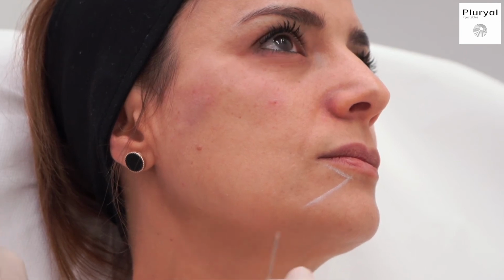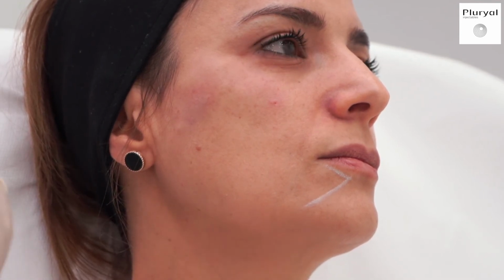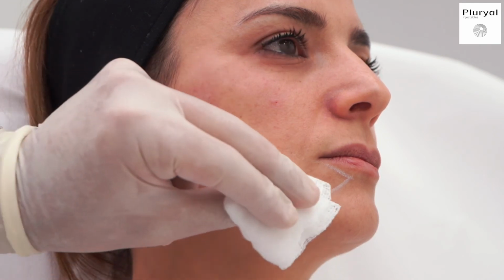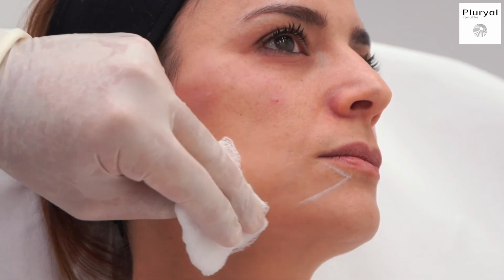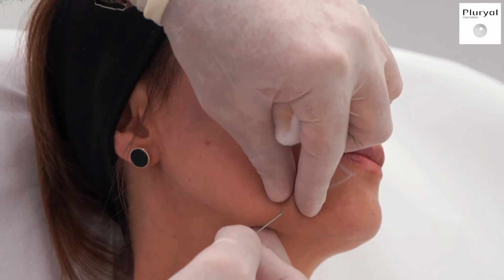The last part of today's treatment is going to be the marionette area. As we all know, we will be losing volume in this area and the skin will be sunken. We have to give back a little bit of volume to have the smooth transition between the cheek and the chin. I will also be using Pluryal volume lidocaine here and using the fanning technique subdermally. So I will do a small hole.